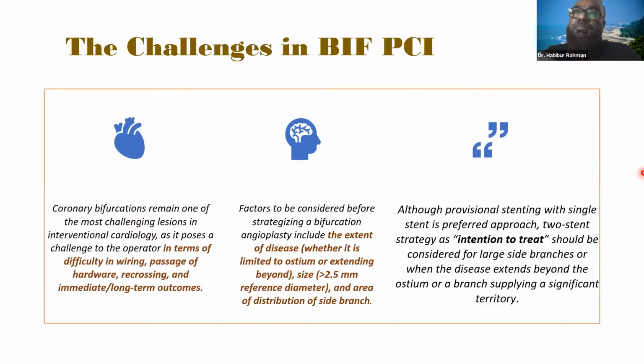So what are the challenges in bifurcation PCI? First, the coronary bifurcation remains one of the most challenging lesions in interventional cardiology, we all agree, in terms of difficulty in wiring, as already discussed, passage of hardware, recrossing, and immediate and long-term outcomes. Factors to be considered before strategizing bifurcation angioplasty include the extent of disease, the size of the side branch, and the area of distribution of the side branch.